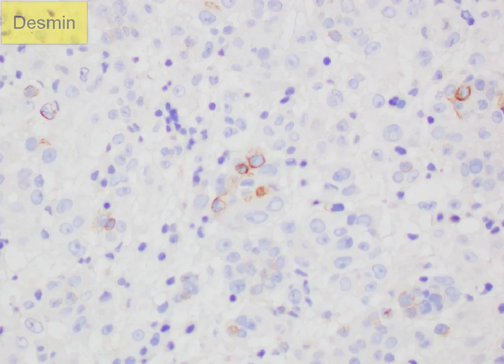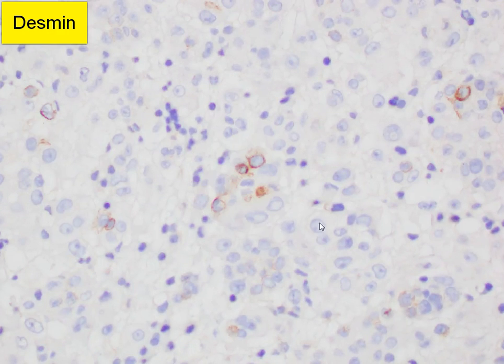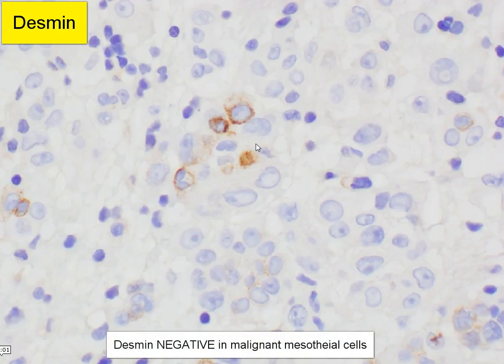The final immunostain here, which is Desmin, is also quite useful to some extent in delineating reactive from neoplastic mesothelial cells. In reactive mesothelial cells, Desmin is positive in the cytoplasm, so you can see it staining some of the smaller cells here. However, in malignant mesothelioma, Desmin is usually negative. This is not an absolutely specific or sensitive test, but used in combination with EMA as well as mesothelial markers, it can be very useful. Here is a higher power view where you can actually make out the cytologically malignant mesothelial cells that are negative for Desmin, as opposed to the smaller, benign-appearing mesothelial cells.